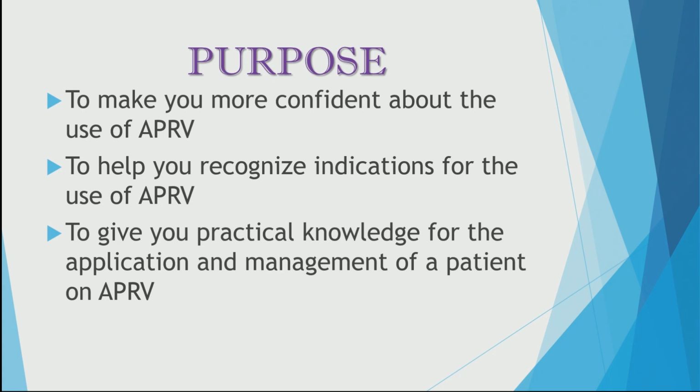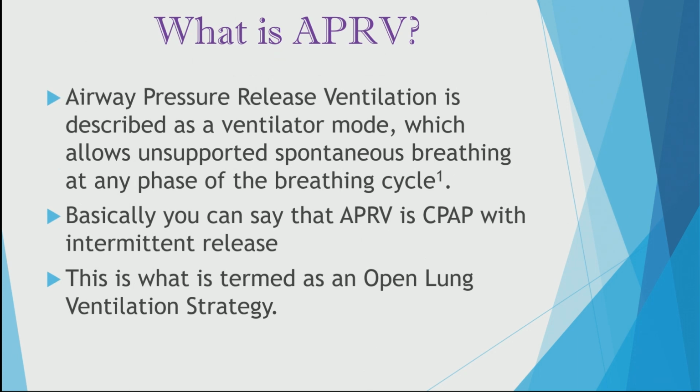So first, what is APRV? Simply put, APRV is airway pressure release ventilation. It is a mode of ventilation which allows for unsupported spontaneous breathing at any phase of the breathing cycle. I don't want that to sound confusing.